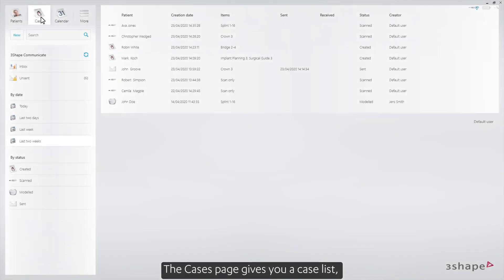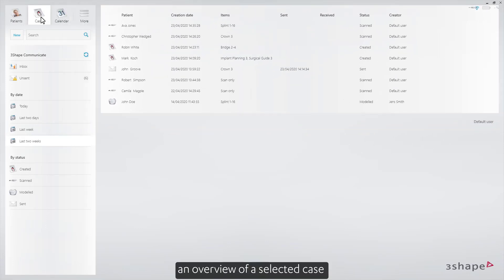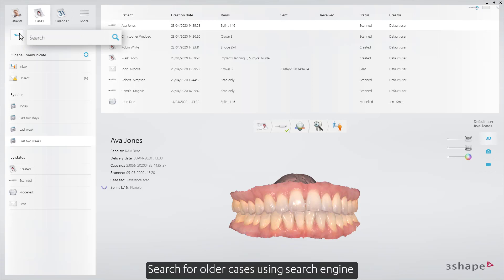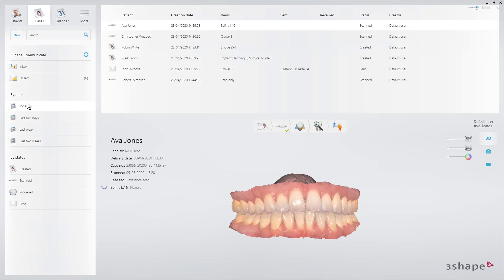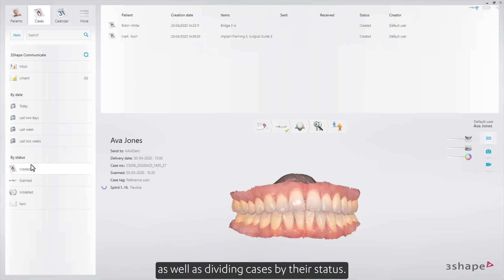The Cases page gives you a case list, an overview of a selected case, and the possibility of new case creation. Search for older cases using the search engine or by using the date functionality, as well as dividing cases by their status.